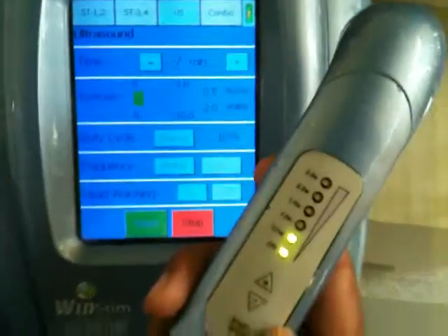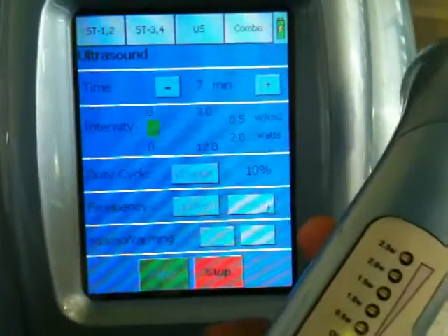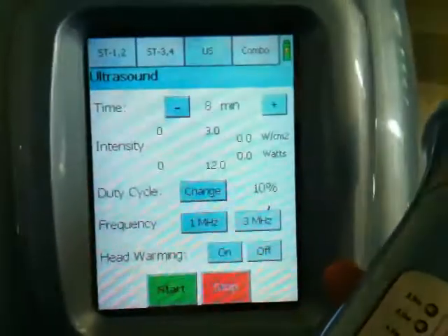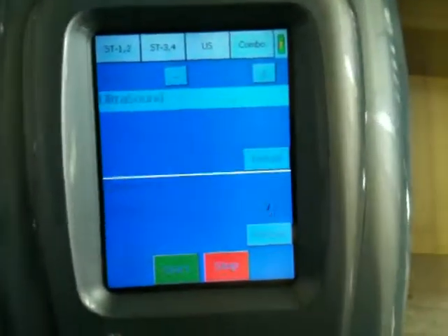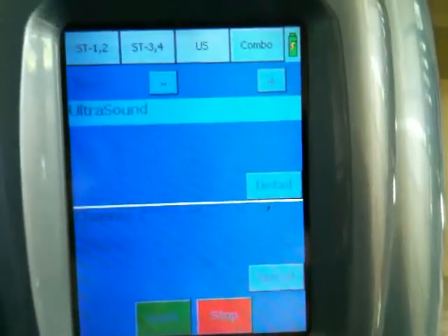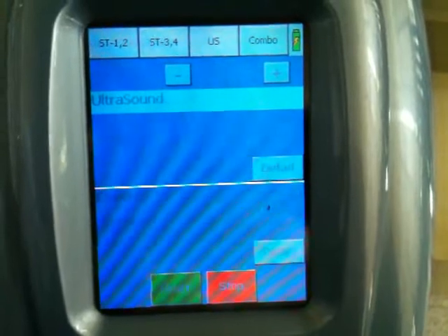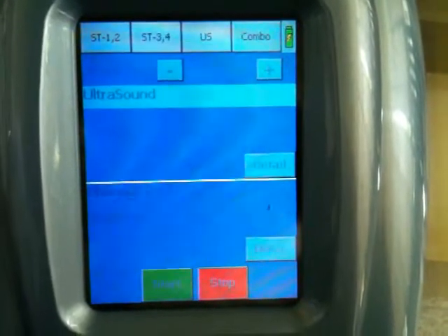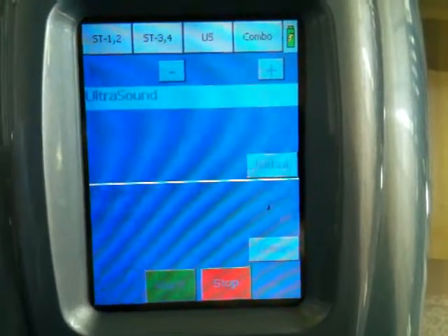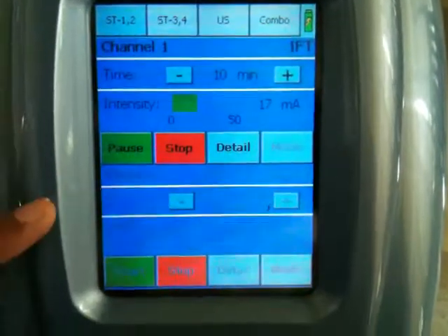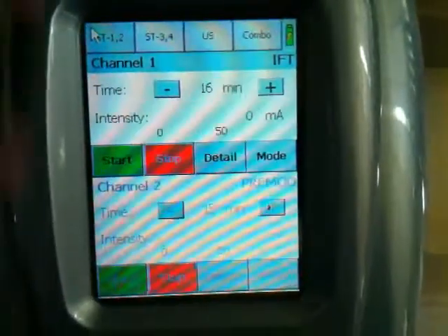Now we are stopping the ultrasound treatment and moving to the combination modality. Let's go to the combo part. As all four channels are busy and the stimulation channel is busy, we need to stop either of the channels. We are stopping IFT. Now let's go to combo.